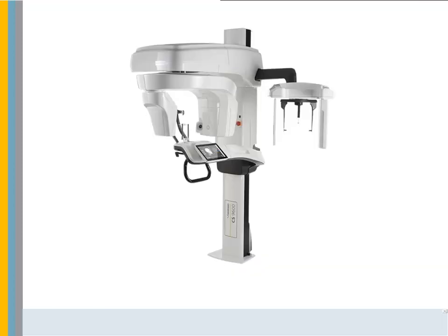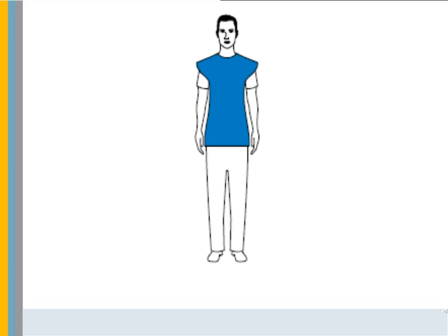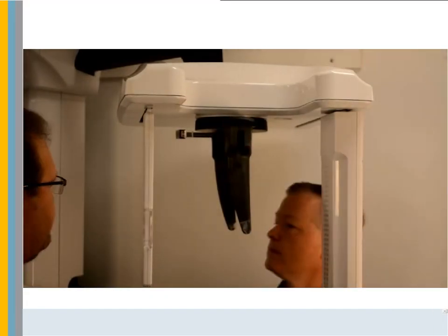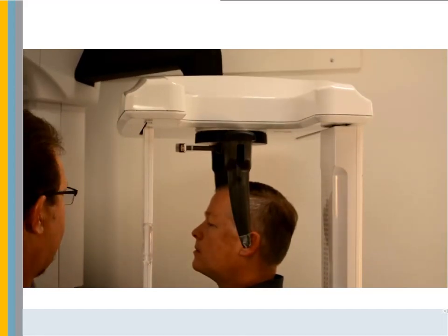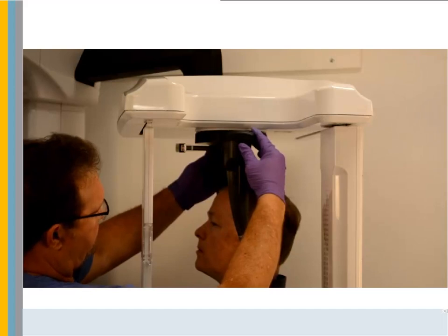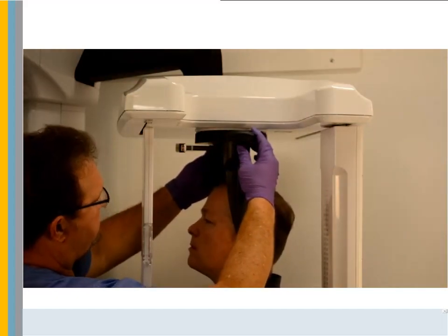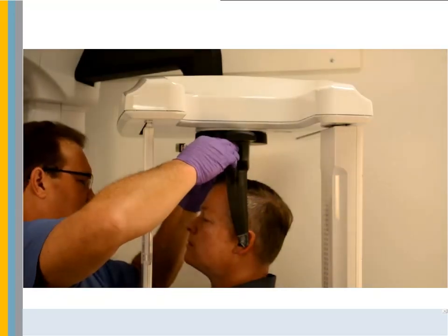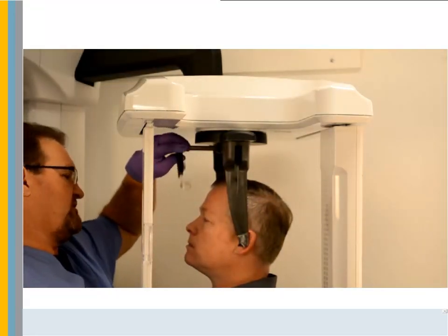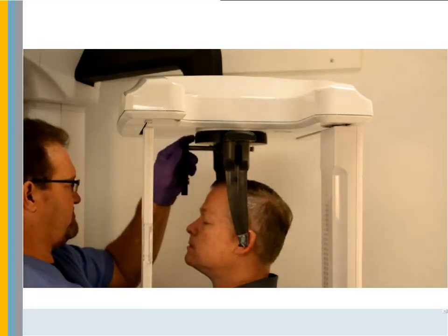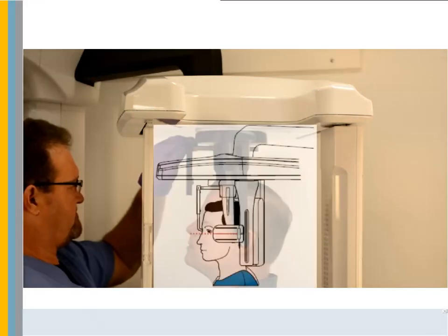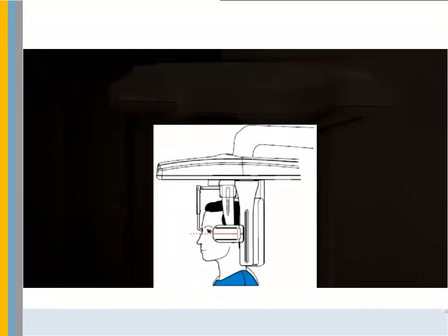Before taking X-ray images, make sure all metal objects are placed in the jewelry tray and a lead vest is placed on the patient. Make sure the head clamp bar is fully open and covered with an ear cone sheath. Do not pull from the bottom of the head clamp. After the unit is at the correct height, ask the patient to enter the unit and slowly close the head clamps. Then lower the Nasion bar, align it, and align the patient's head on the Frankfurt plane. Take the scan.